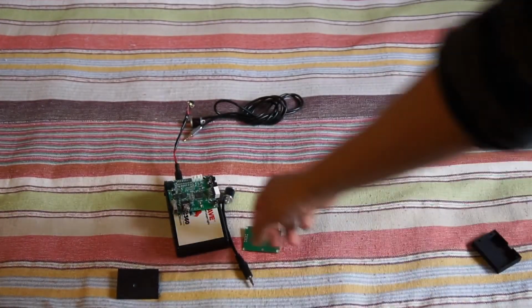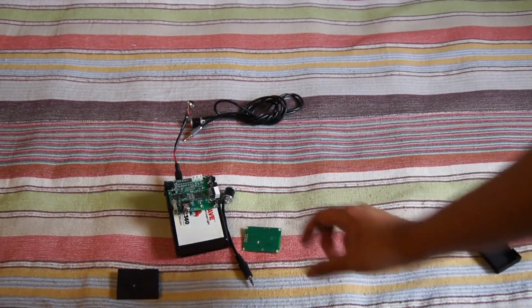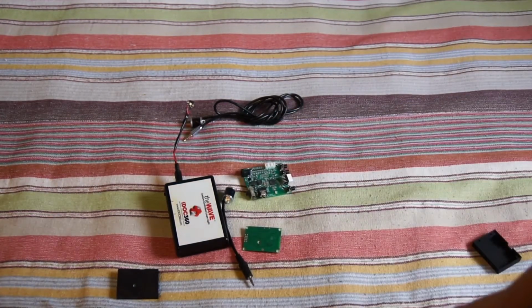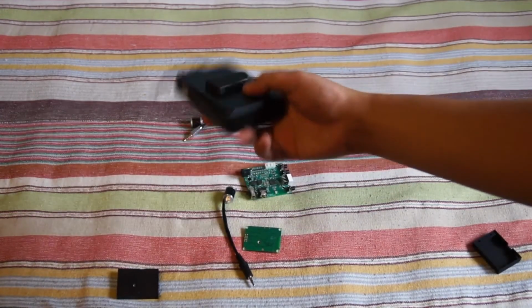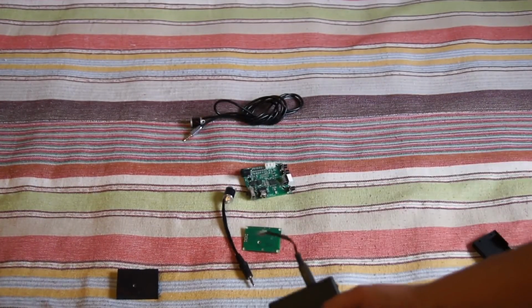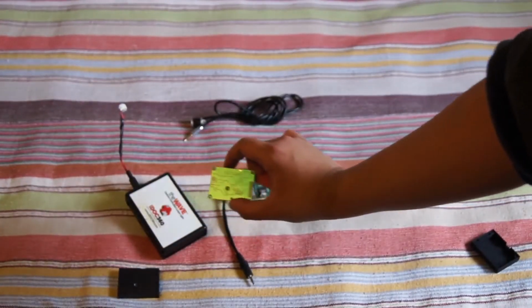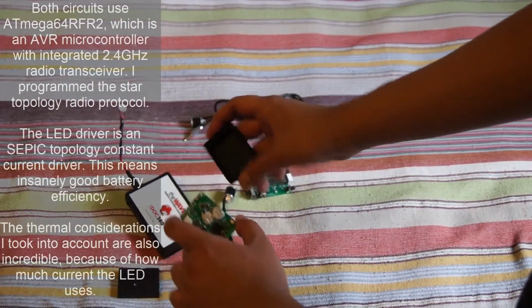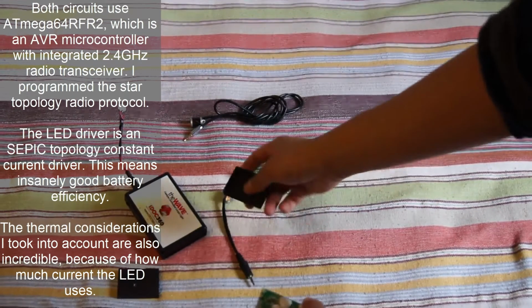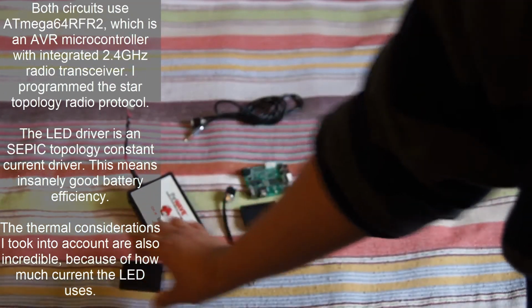This is the circuit inside here. You can see it takes up half the space. That other half is all battery. What else? Belt clip. I'll show you, this is the remote circuit. This is the 3D printed prototype case, and the real case is machined plastic, machined ABS, I believe.